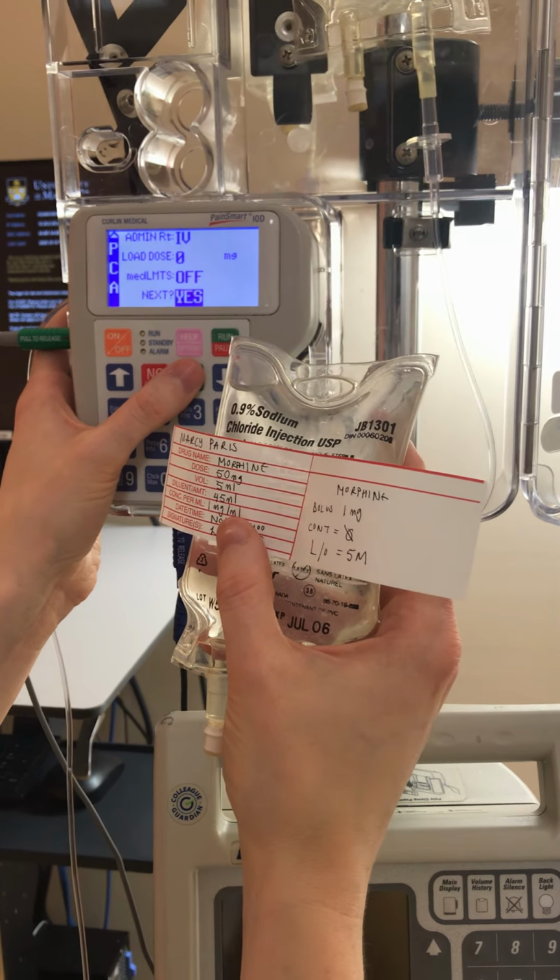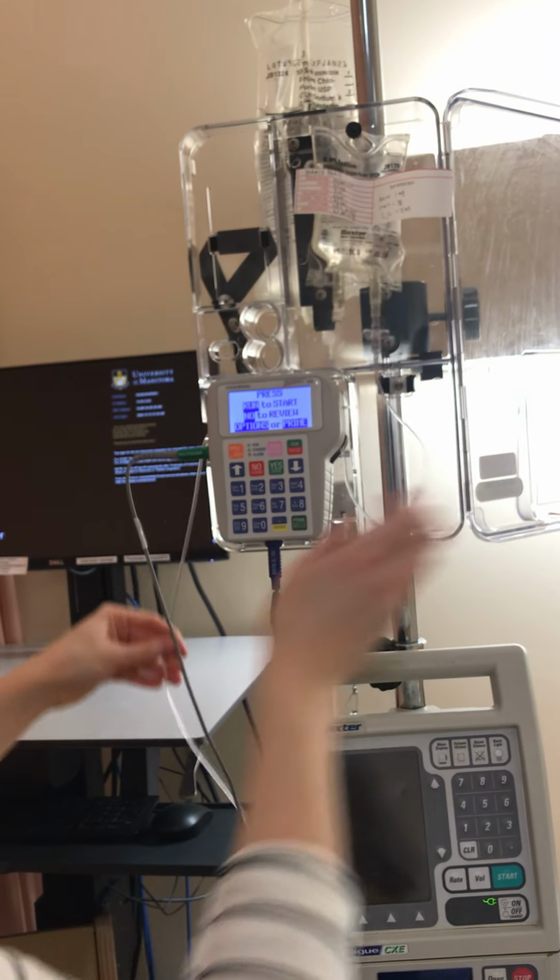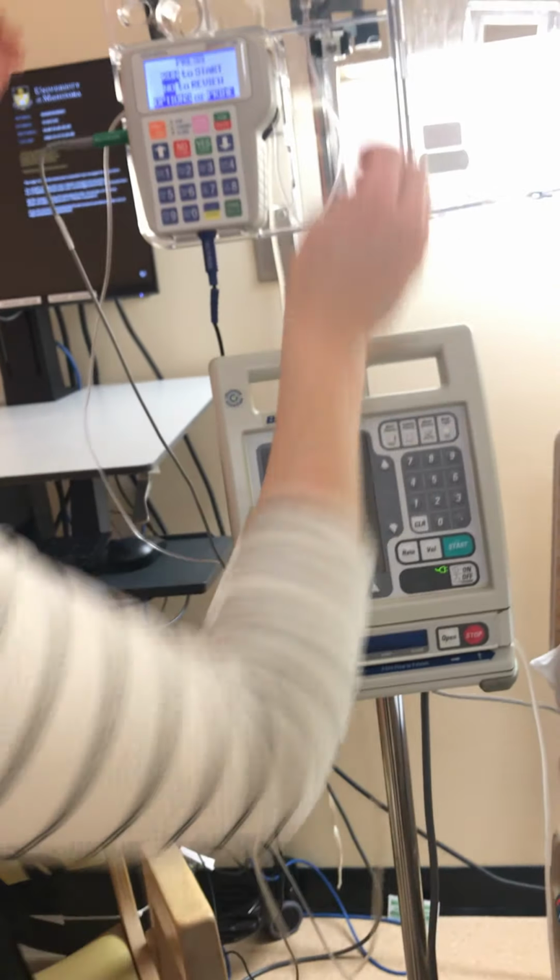Excellent. Can I hand this to you? You can just throw that out. That's an empty bag. Okay, so maintaining the sterility of both of these, I'm going to spike the bag. Okay, excellent. And I'm going to make sure this is good.